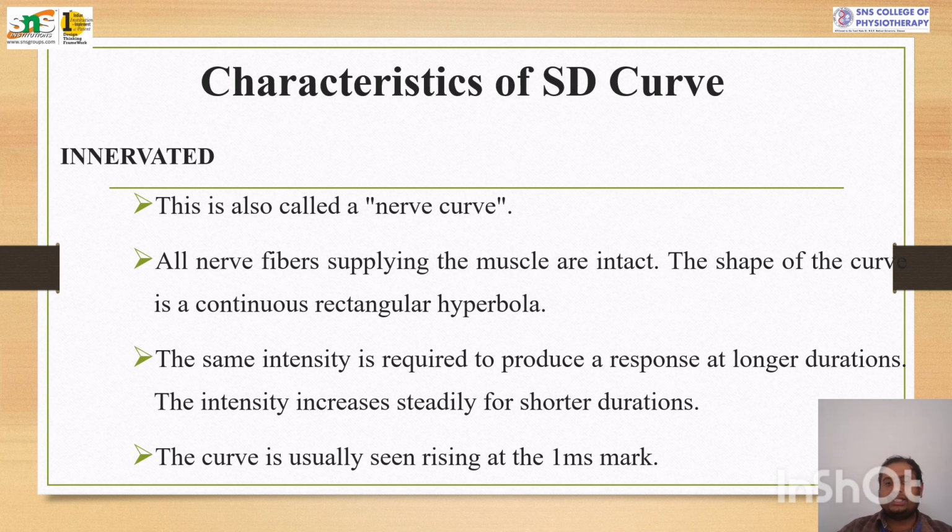If the same intensity is required to produce a longer duration, then we can use the next levels of intensity. The muscle will accommodate to a recurrent same stimulus. Then if you are giving any stimulus, it won't respond, and then we can't mark the strength duration curve.